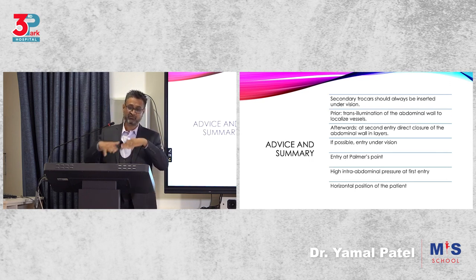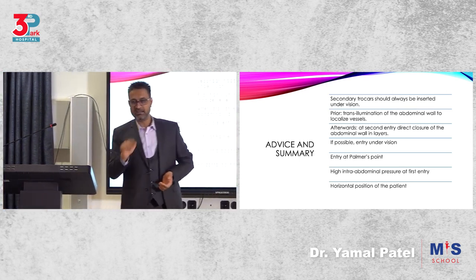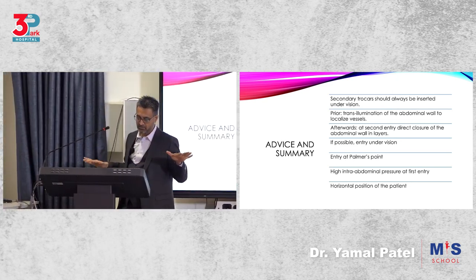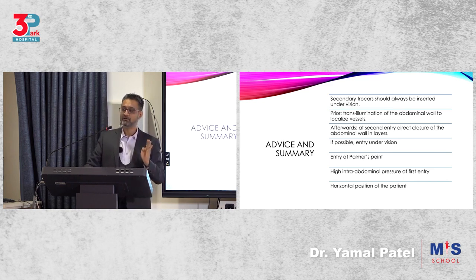You should know your entry points: the umbilical, intra-umbilical, supra-umbilical, infra-umbilical, Lee Huang's position, Palmer's point, and Jain's position. These positions should be known to us, and this should all be done with the patient in the horizontal position. As I've said, don't give a head low before your ports are in.